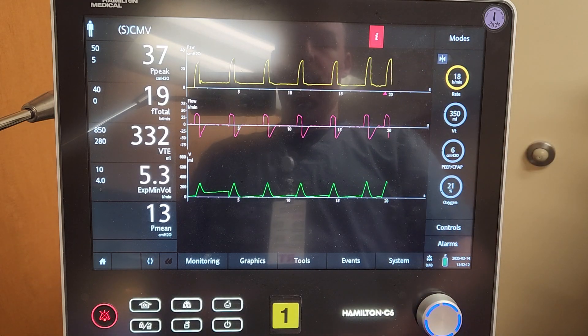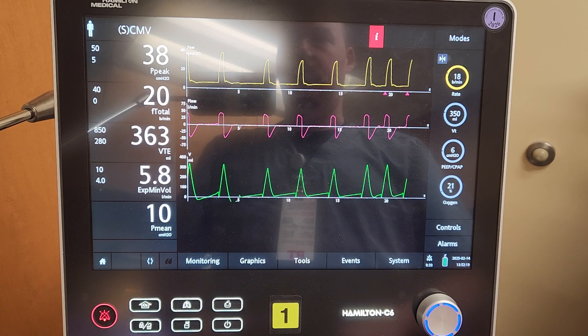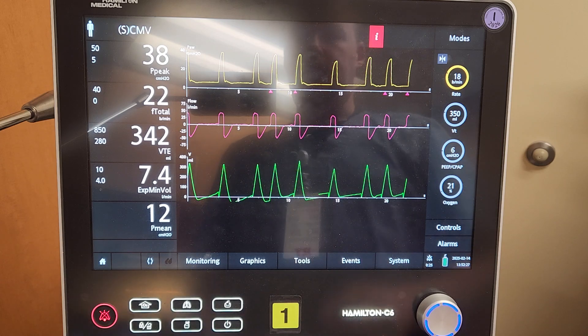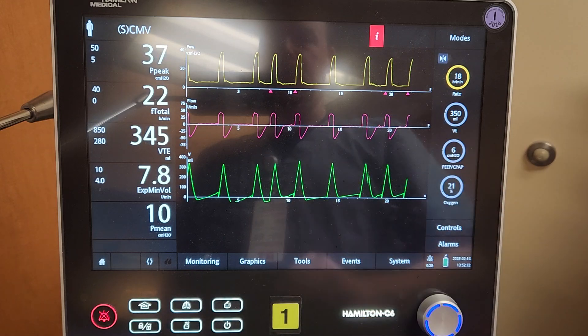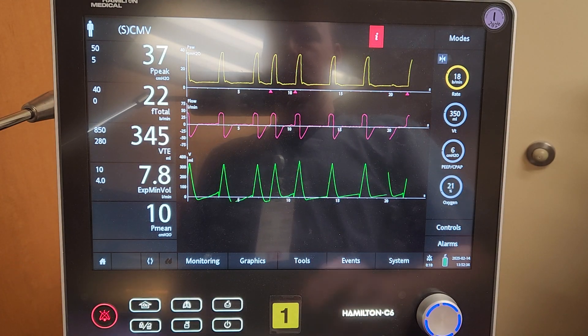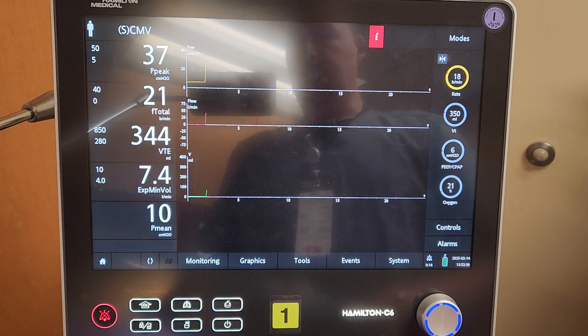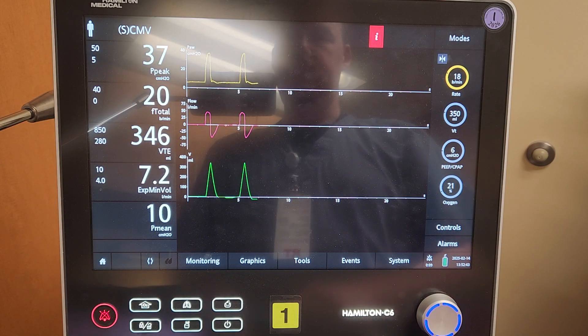If you're trying to find whether the patient is actually triggering breaths — remember with the AVEA, all mandatory breaths were coded red and assisted breaths turned yellow. Unfortunately with this ventilator it doesn't change colors, but it has little triangles underneath each breath where the patient has manually taken a breath. Otherwise there will be nothing below it.